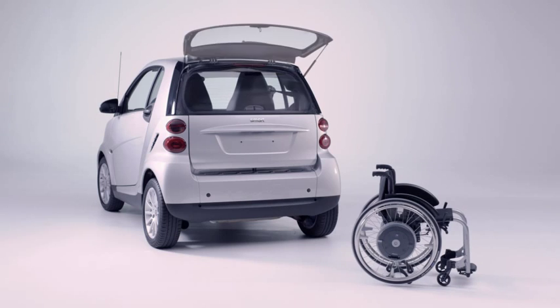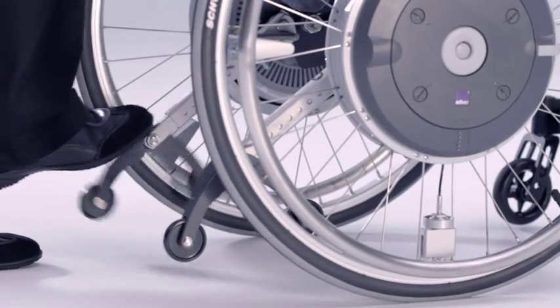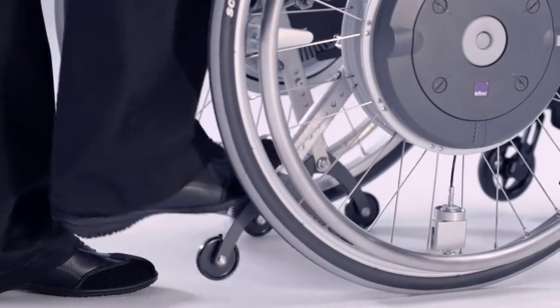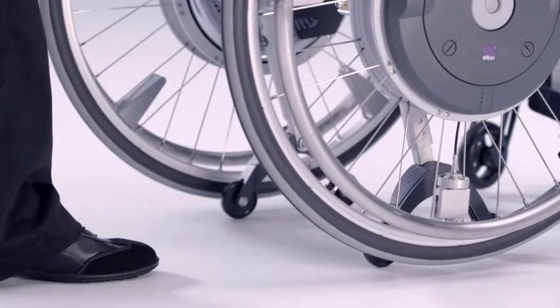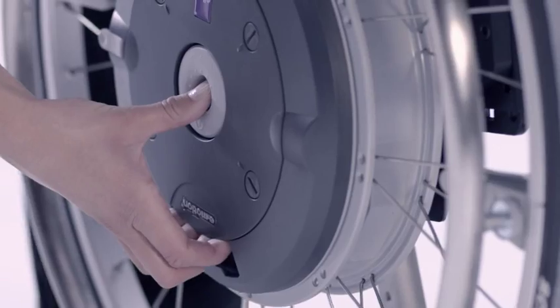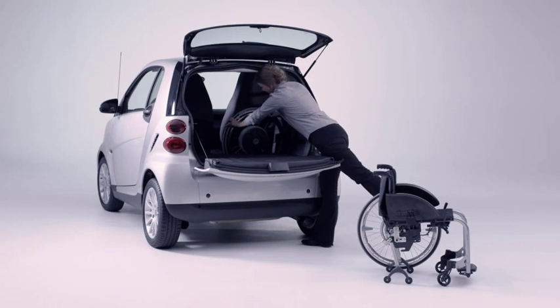E-Motion is also an ideal travelling companion. The anti-tippers even have two functions: they prevent tipping and also make it easier for you to remove the wheels. The wheels are removed via a quick-release axle, making them easy to transport in the car.